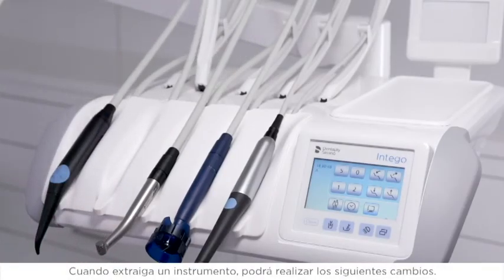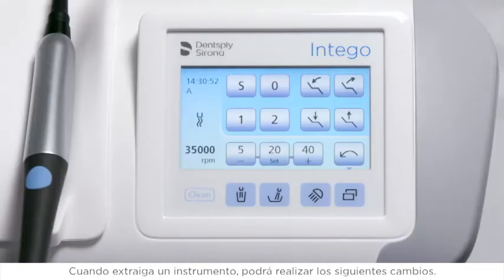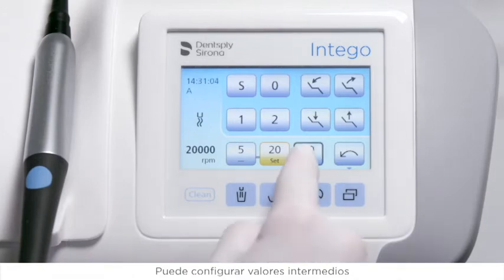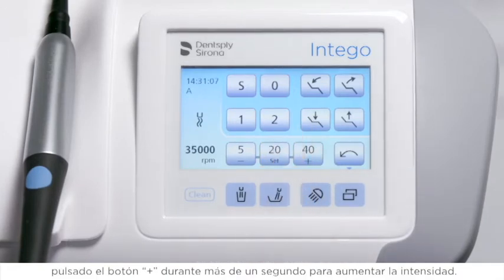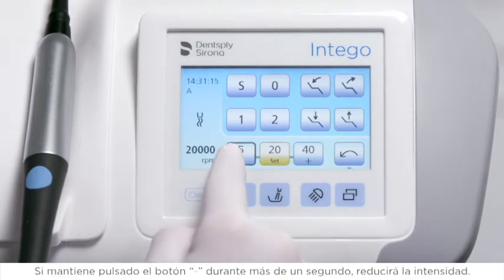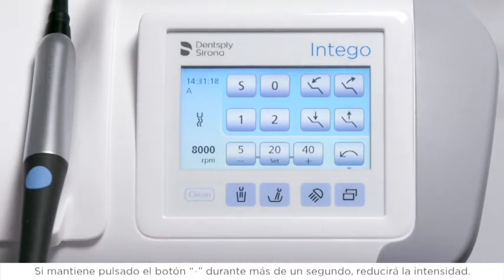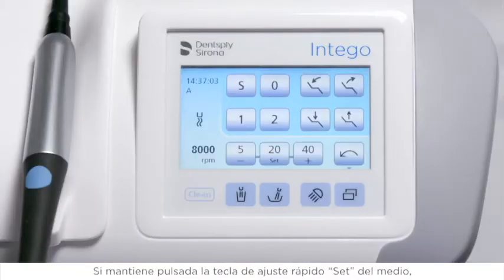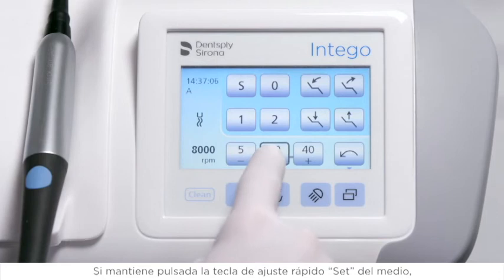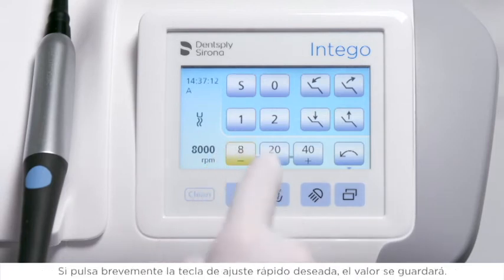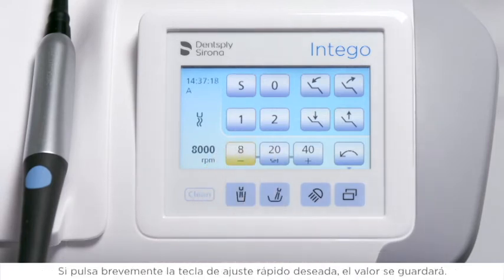When the instrument is removed, you can make the following changes. The preset value on the quick setting keys can be selected by touching them briefly. You can set intermediate values by pressing and holding the plus button for more than one second to increase intensity, or the minus button for more than one second to reduce intensity. Each quick setting key can be preset individually. Pressing and holding the middle quick setting key activates the programming mode and the values flash on the touch panel. By briefly pressing the desired quick setting key, the value will be saved.